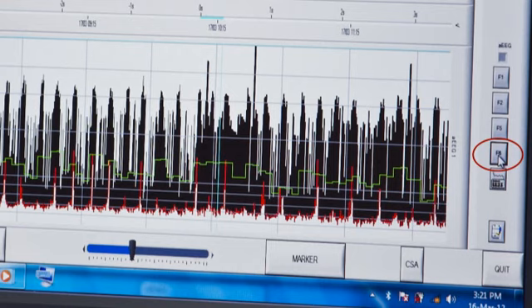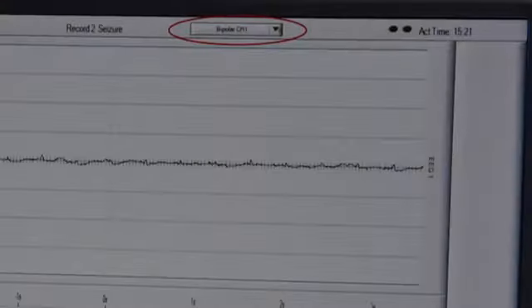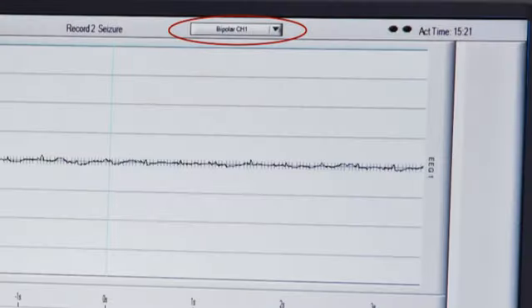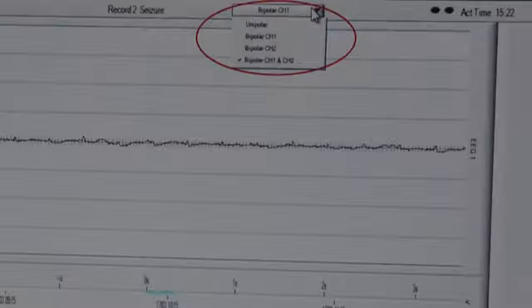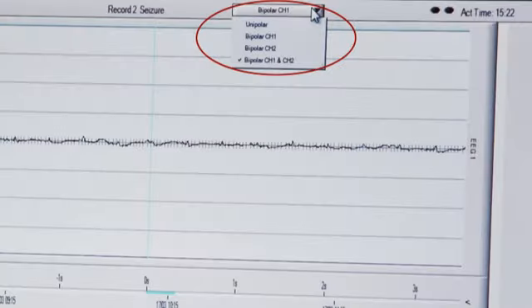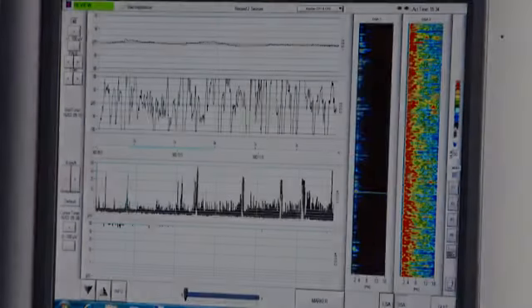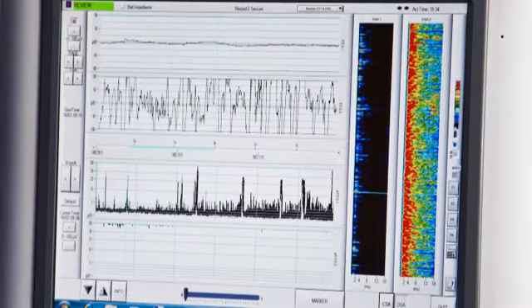You can change the recording layout to review different channels by clicking on the drop-down menu at the top of the screen. Click on Bipolar CH1 and CH2 to view the left and right AEEG and EEG.